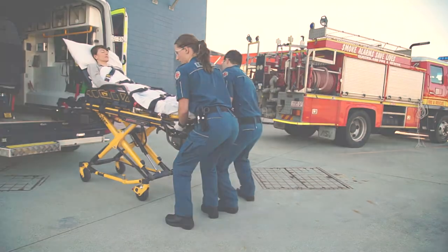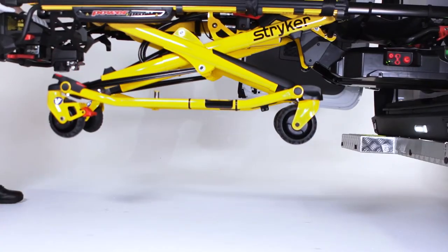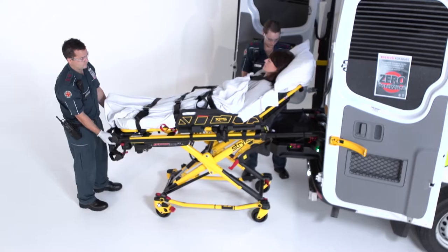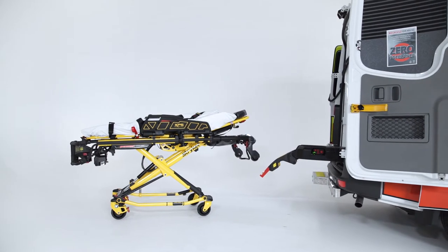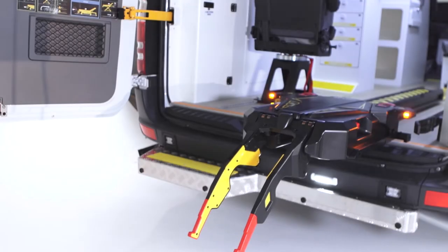As the following videos will demonstrate, this equipment is not merely a new stretcher. It is fundamentally an entire new system to help you better serve your patients and look after yourself. It is important to review all the training videos and fact sheets to ensure your safety and the safety of your patients.